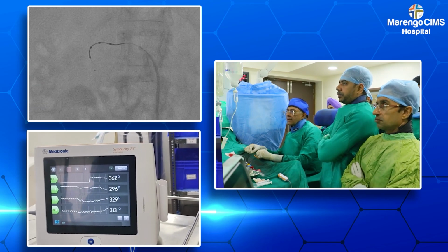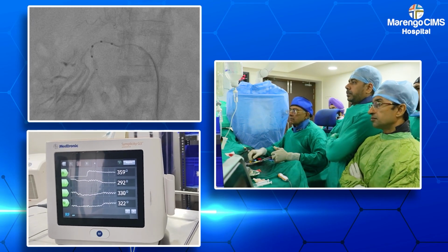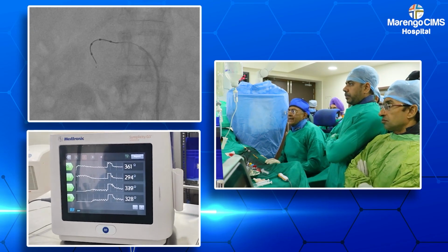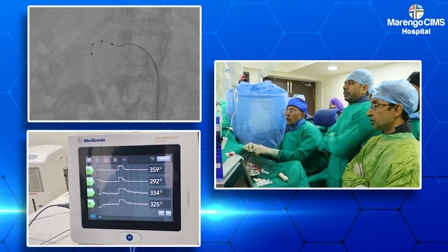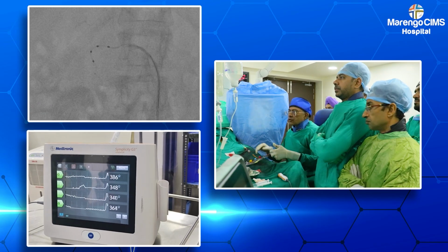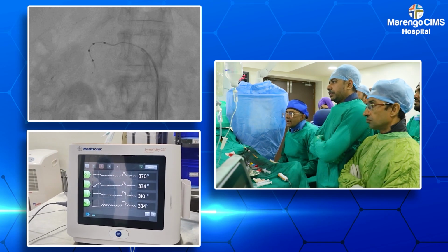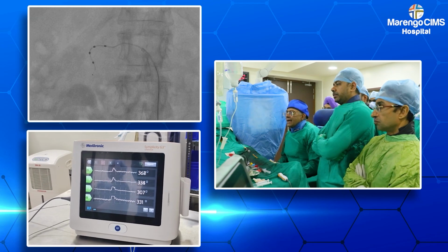And we have pulled back the wire again. Again we will check. So now we may be in the overlap area, so we may still pull back a little bit. So we can switch off the second one, sir, and then we can still do. No, the distal is in the overlap area. To get the perfect position of our second electrode, to make sure the second electrode is beyond the carina but still proximal to the previously ablated area.